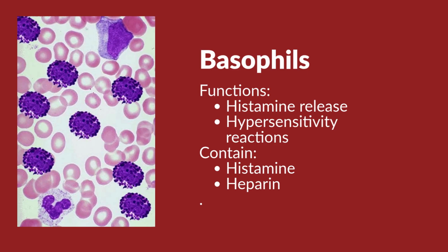A memory trick for this: basophils burst with histamine. Basophil morphology: you can recognize them, like I said before, by their dark blue-purple granules, coarse granules, and granules that may cover the nucleus. The nucleus is usually bilobed, difficult to see because of the heavy granules. A memory trick is basophils are dark and messy, like that picture here. Basophil granules are large, coarse, deep purple, black, blue. These granules are packaged with inflammatory mediators.